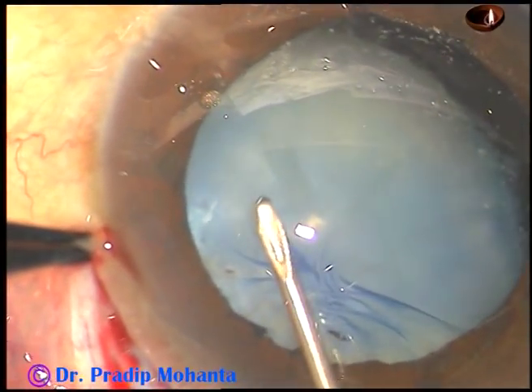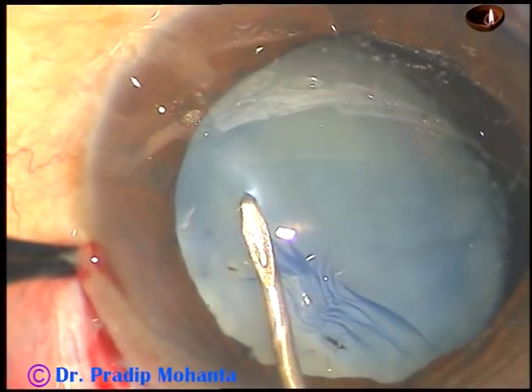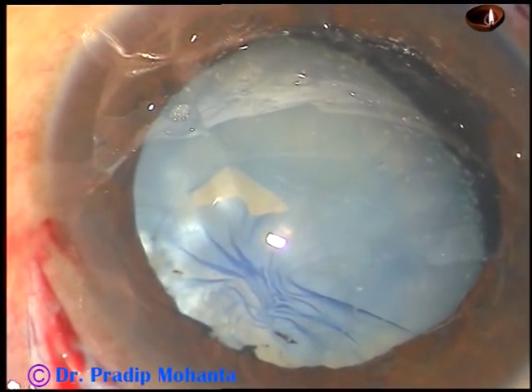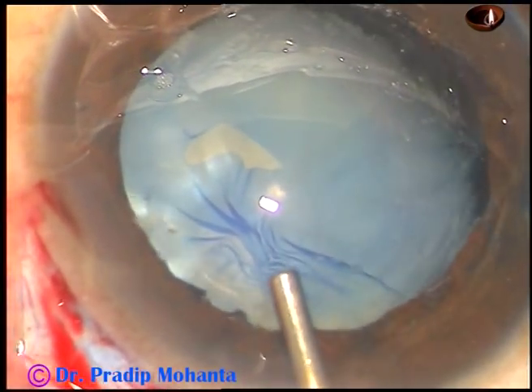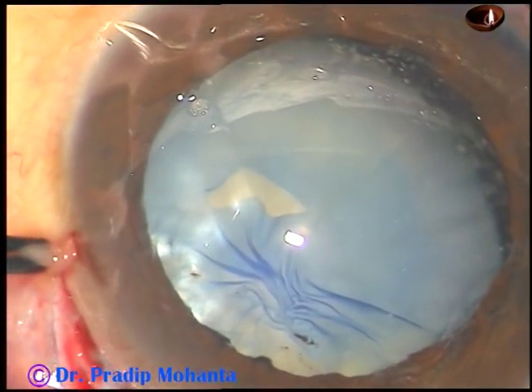All the incisions have been made. The capsule has been stained with trypan blue dye, and now capsulorhexis is being attempted. As you can see, the cataract is swollen and there is some amount of intumescence. There is fibrosis of the anterior capsule superiorly.